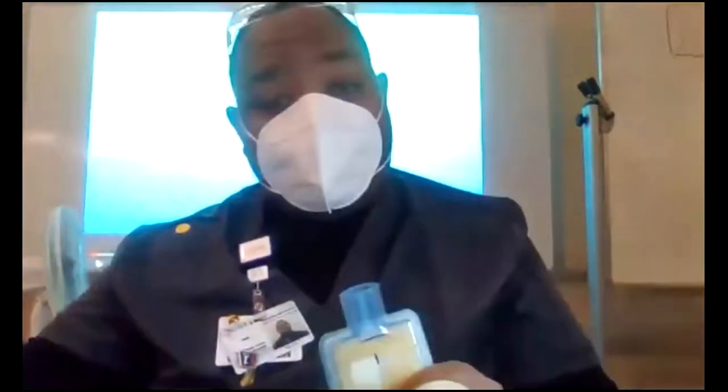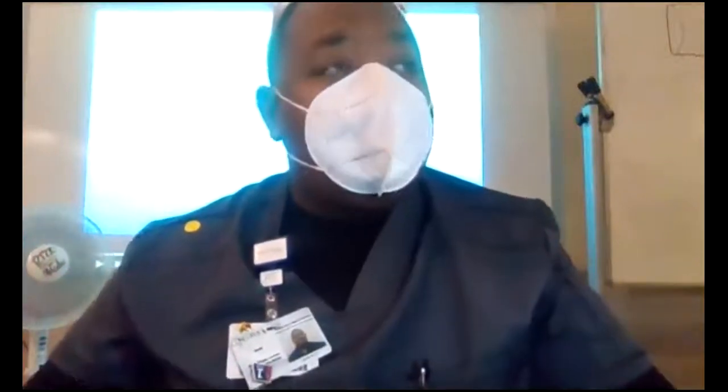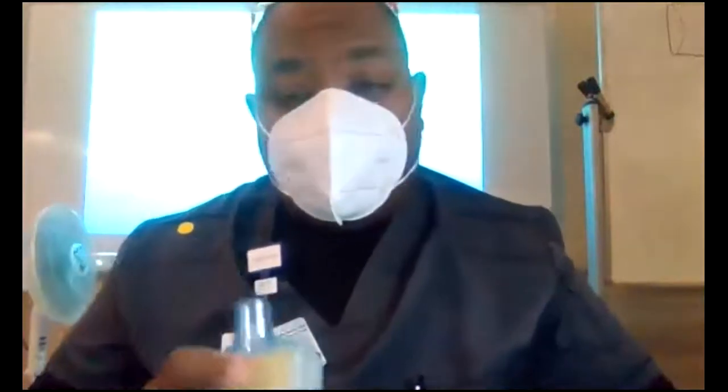I'm going to go get you guys some brand new filters that you can put your mouth on. Brand new filters that block anything. Very expensive, so don't lose it. You can keep it, so when we do other things you can keep using it, because it's about $20 or $30 a pop. You'll put your mouth on it, and I'm going to let you blow into one and suck back in, and you're going to feel the heat and the moisture come right back to you. You might not feel much moisture because of that filter, but you will feel the heat come back to you. I'm going to pause the recording here for a break.